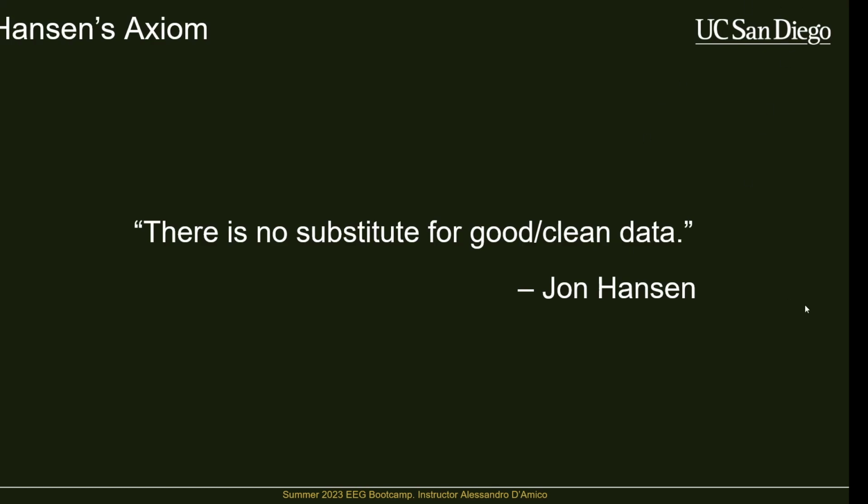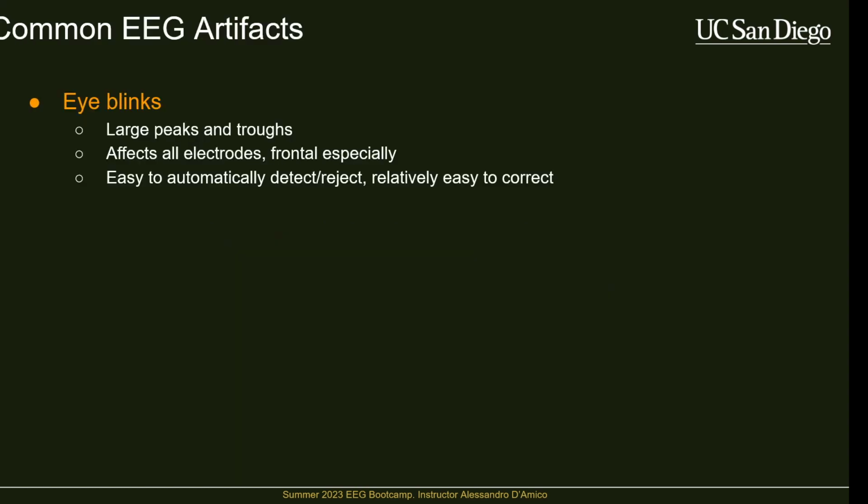There is absolutely no substitute for good, clean data, even though when you talk to a lot of people who are bioengineers, not to throw you under the bus, they assume that you can just fix any data with enough signal processing or modeling, but that's absolutely not the case. Well, at least not currently. Maybe one day we'll have some magical algorithm that can fabricate data from nothing, but for now, there is no substitute for recording good, clean data.